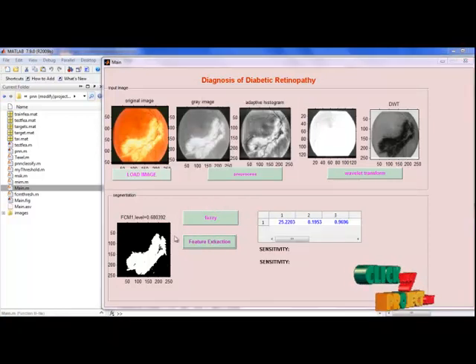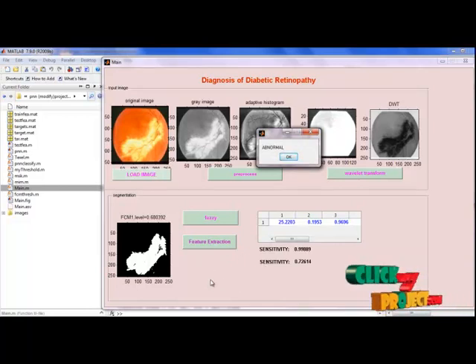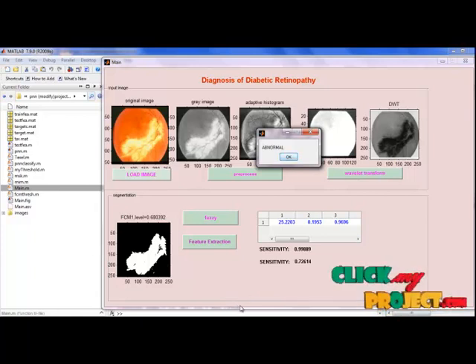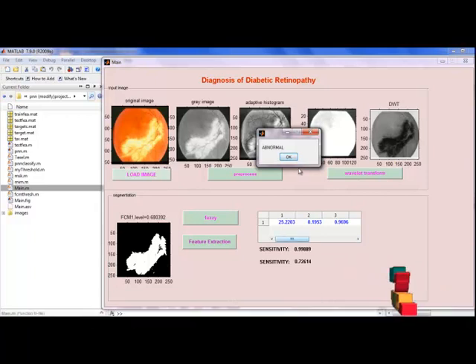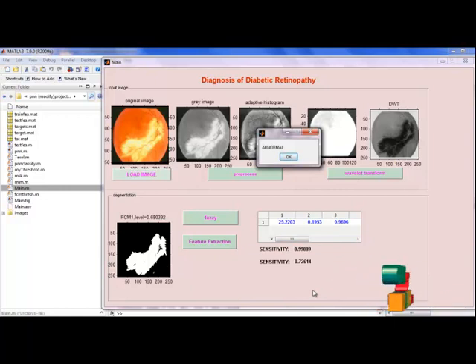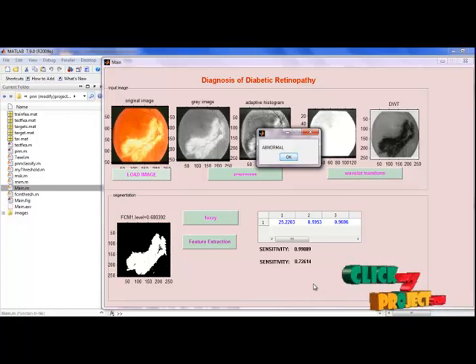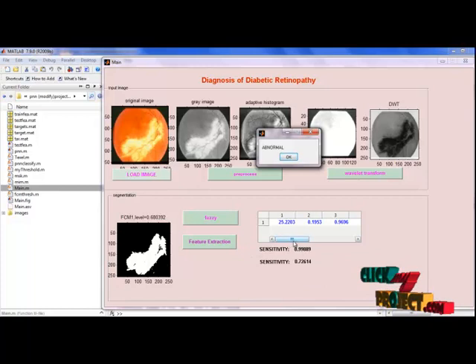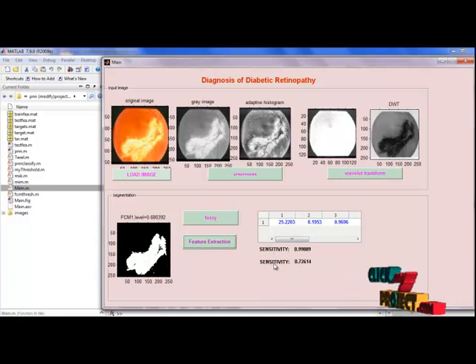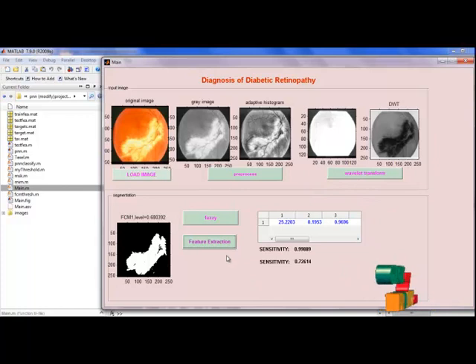The next step is feature extraction using GLCM. Each element is divided by the sum of all elements, so the elements of the GLCM may be considered as probabilities. The selected features are calculated using only the values in the GLCM, from which several statistics are derived: contrast, correlation, inverse difference, sum of squares, sum of average variance, and entropy — calculated for texture images. Sensitivity and specificity are also calculated. Finally, the segmented image is classified by PNN classification, providing normal and abnormal image results.